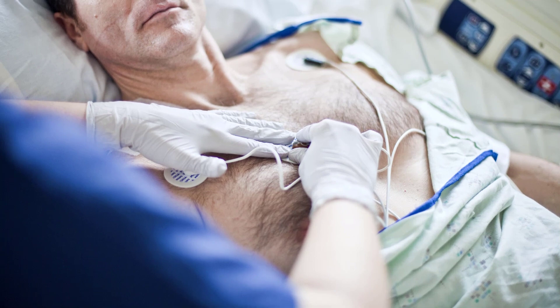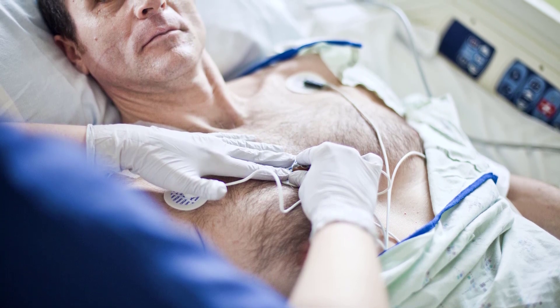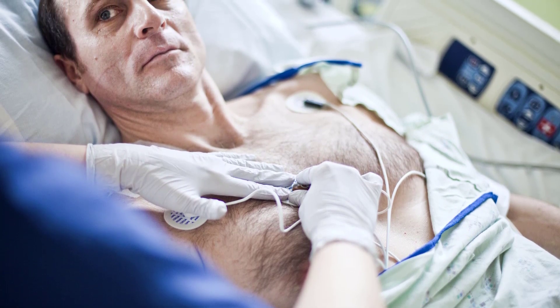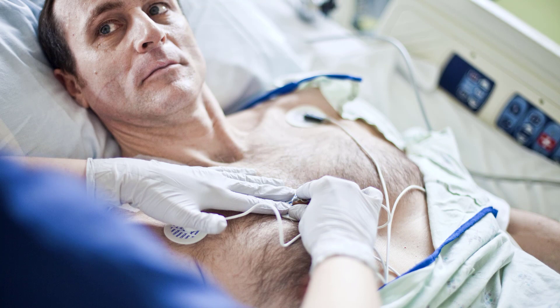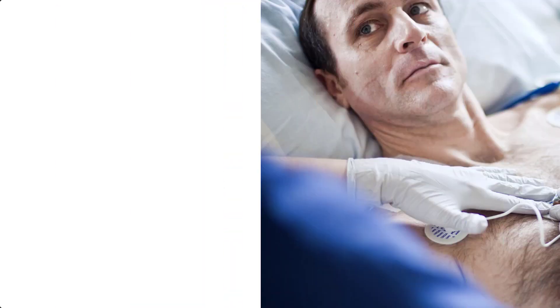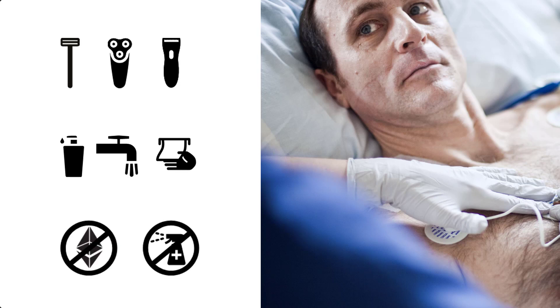Now you can start monitoring vital signs. Give extra attention to good skin preparation before applying ECG electrodes. Good electrode-to-skin contact is important for a noise-free ECG signal, as the skin is a poor conductor for electricity. Select sites with intact skin. Clip or shave hair from sites as necessary. Wash the sites thoroughly with soap and water, leaving no soap residue. We do not recommend using ether or pure alcohol because this dries the skin and increases resistance. Finally, dry the skin thoroughly.